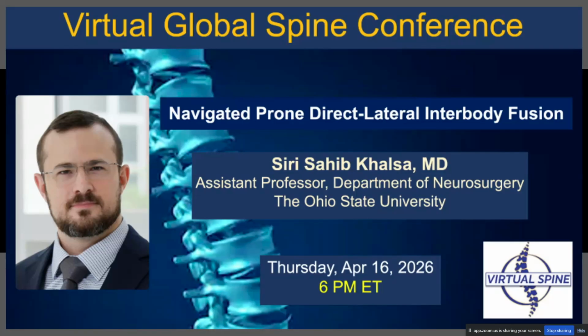So you're basically using cannulated fenestrated pedicle screws, filling those bodies with cement, and then you have a little more support when you expand that corpectomy cage against those end plates. I do find these cases are done sometimes in quite osteoporotic patients that are in big trouble with a fracture that was meant to heal and never healed. And they don't always have time for months of teriparatide beforehand if they're stuck in hospital.